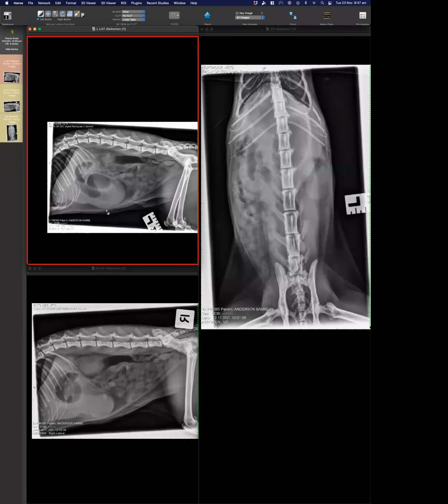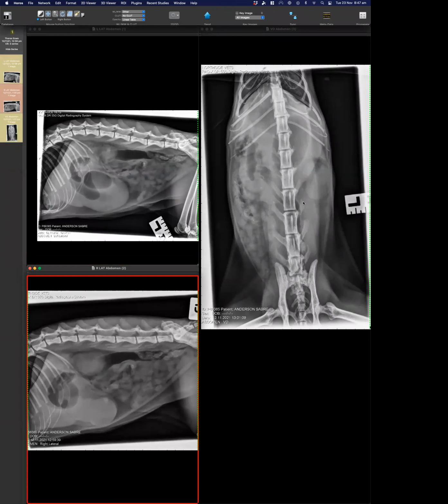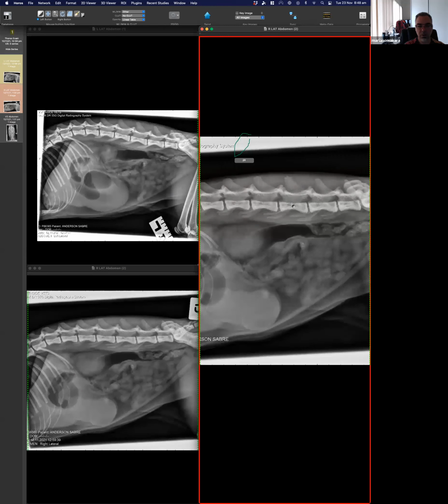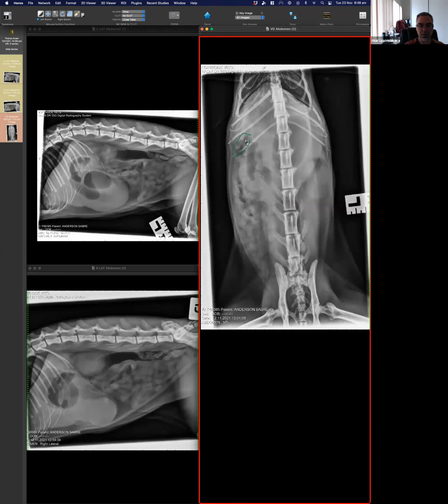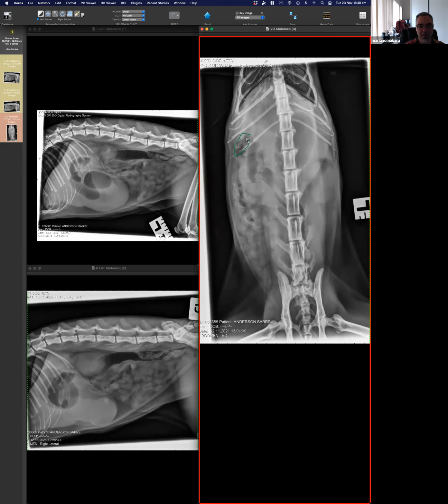Okay. Question before you go. Yeah. I'm on mute. Just to confirm, I'm going to have to try and annotate it again. So if you're looking in the VD, you think this foreign body is probably there? Oh, you moved it. You're tricking me. It's okay. Yeah. I completely agree. I think it's there.